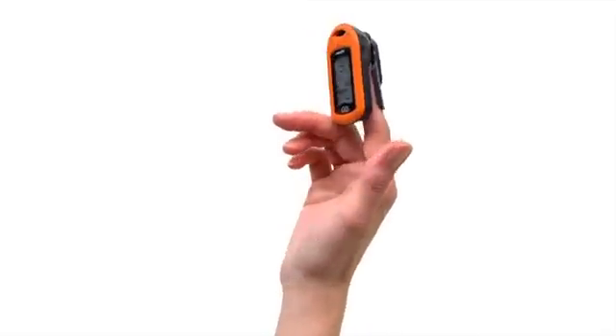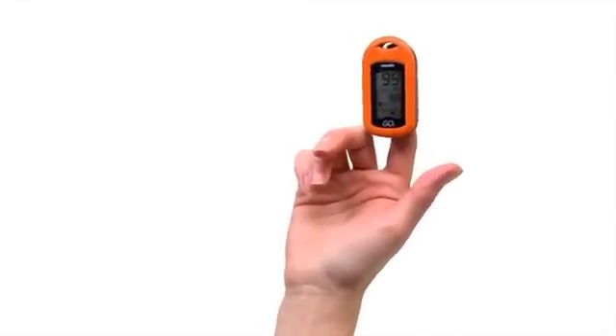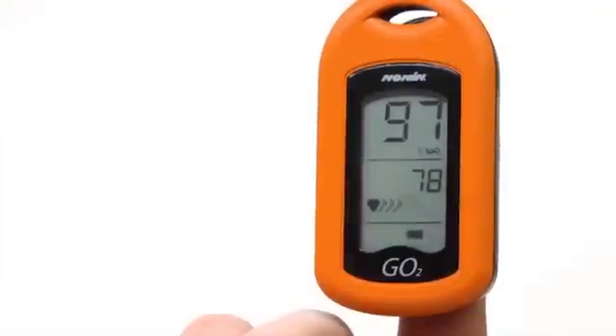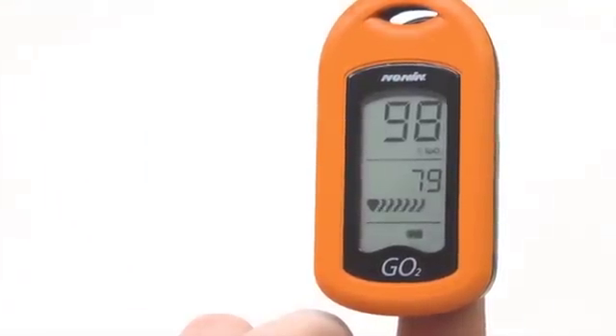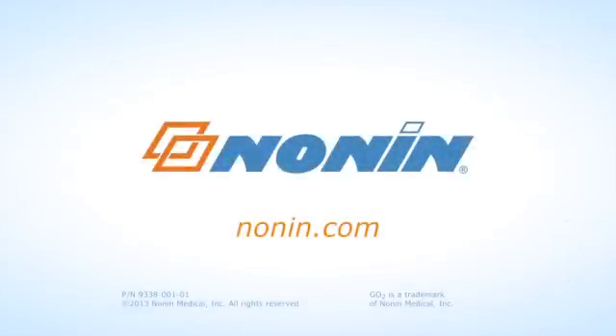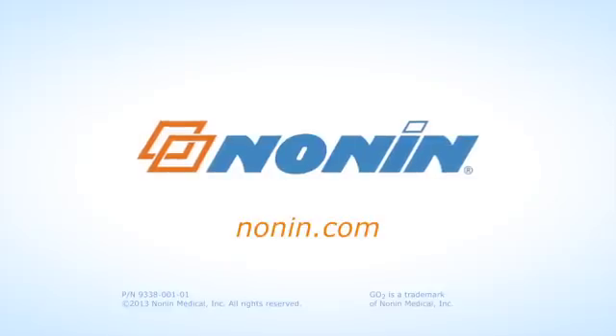With proper use, the Nonin GO2 Pulse Oximeter will provide consistent, accurate oxygen and pulse rate measurement. You can find additional use information on this and other Nonin products at www.nonin.com.